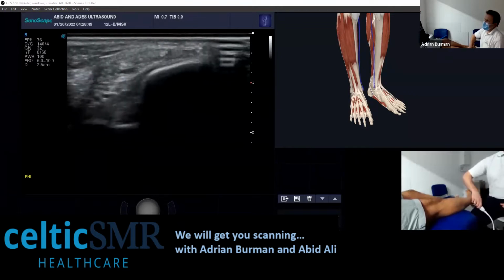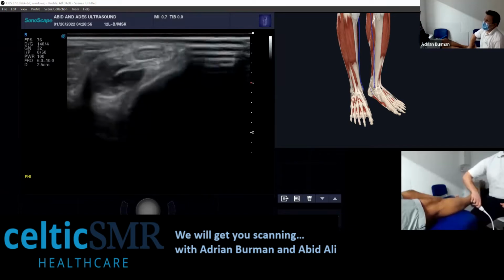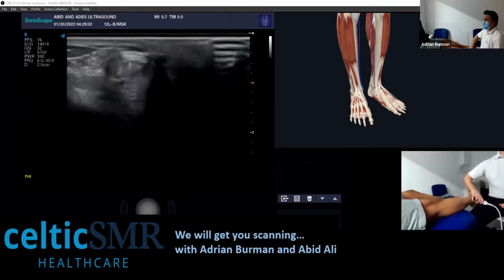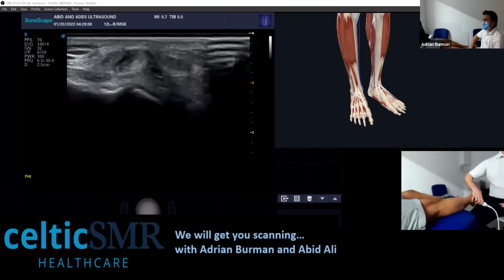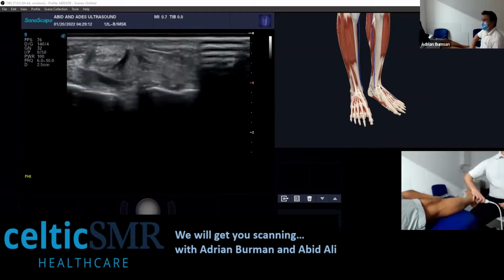Nice. You can see the brevis muscle, that's the brevis muscle there at the bottom. You've got the CFL just underneath there. You can obviously dynamically test that as well.